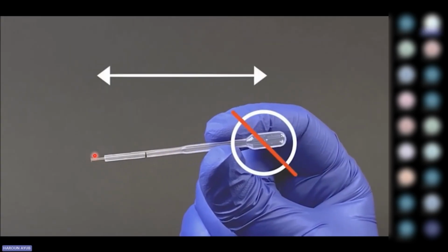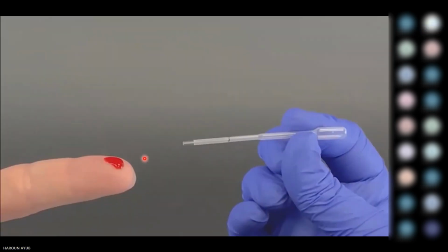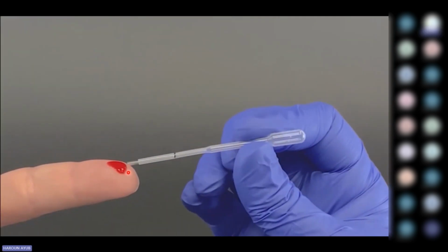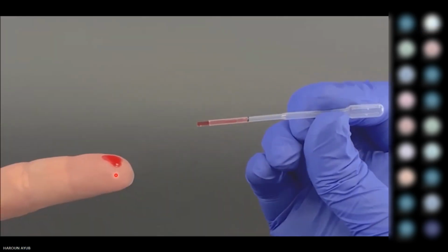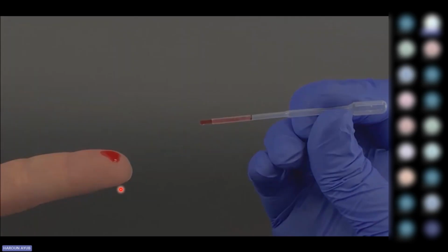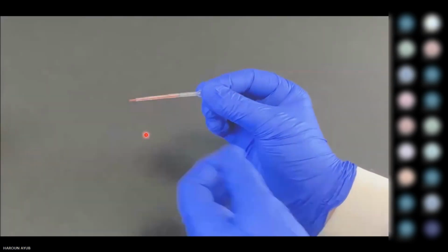This is just the collection of the blood sample. It can be from an EDTA tube or from a direct fingerprick. This makes it a point of care test, and you can move with it anywhere.